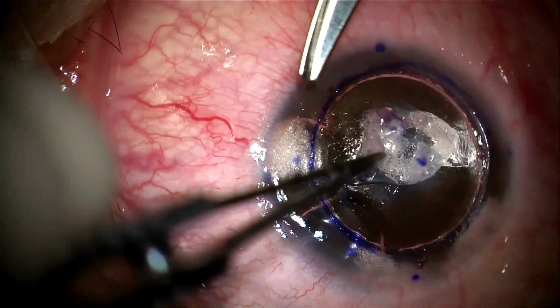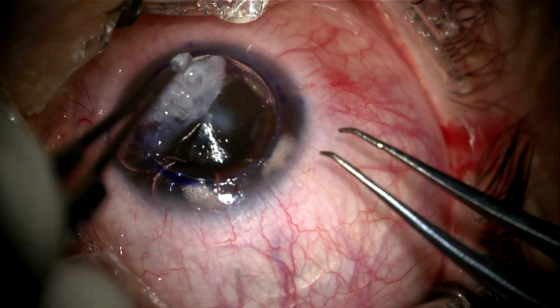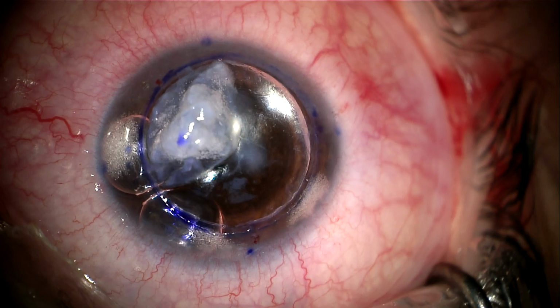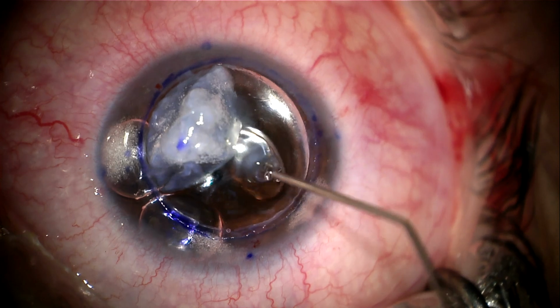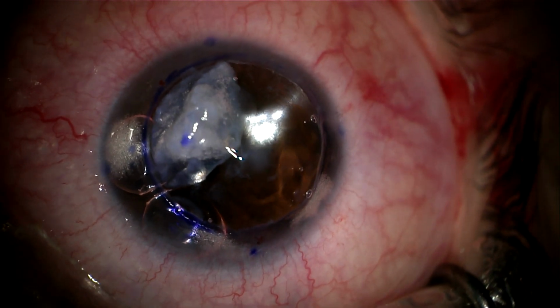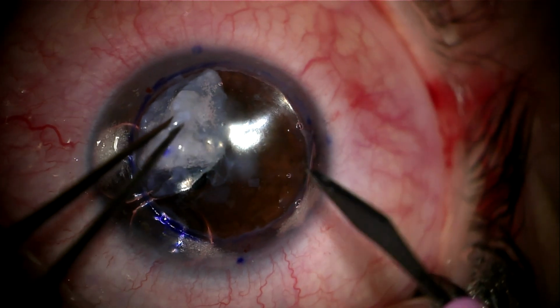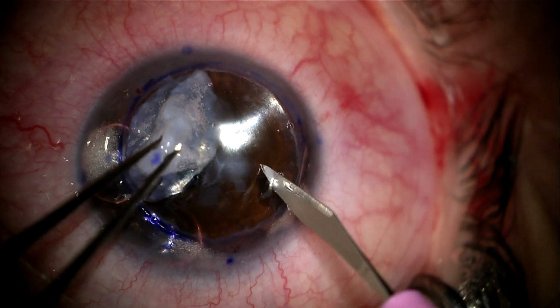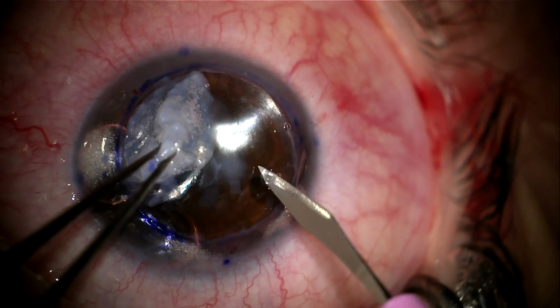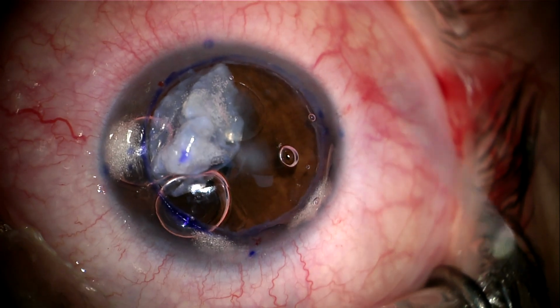During peeling, I realized the scar is adherent to the predescemetic layer and there is a risk of the type 2 bubble collapsing. So I opened the roof of the bubble under viscoelastic and injected some viscoelastic to keep the plane between the scar and the predescemetic layer. Peeling is then completed, removing all the remaining stroma.